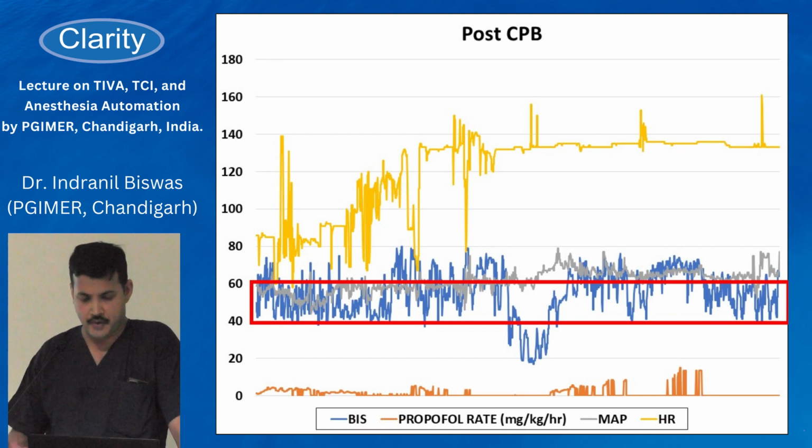Now this is the performance of the case in the post bypass period. Here also there were some ups and downs of the BIS, but on an average it was maintained quite well, and the mean arterial pressure and heart rate were also maintained in a similar manner.